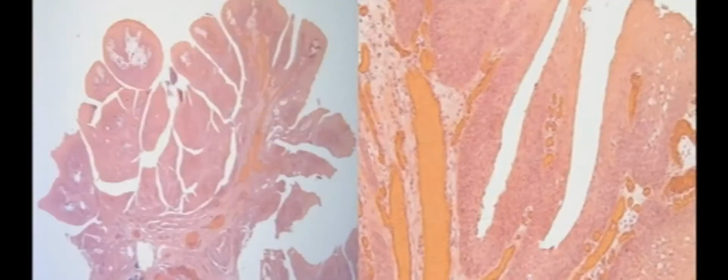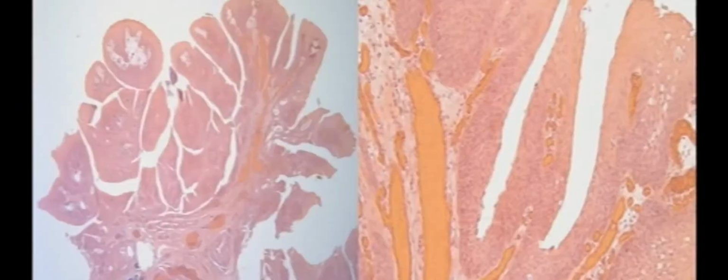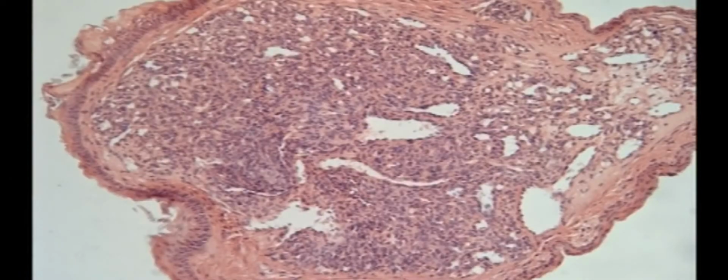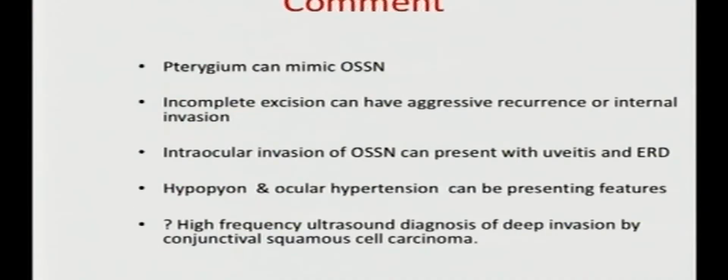Now, as a histopathologist, we require to know whether it is a capillary hemangioma or a pyogenic granuloma. Pyogenic granuloma will have small vascular channels with inflammatory cells, whereas a pure capillary hemangioma does not have inflammatory cells but has small vascular channels as well as endothelial cell proliferation.